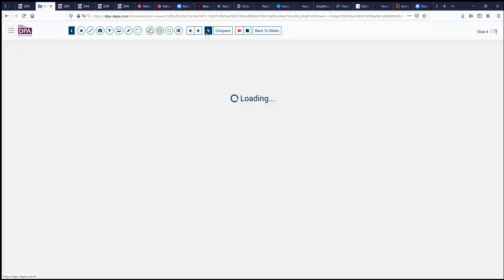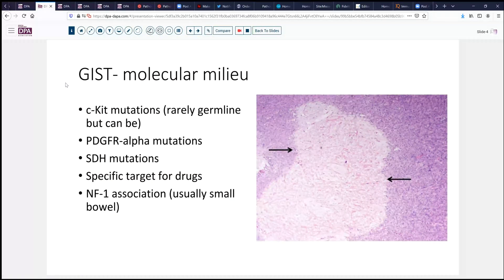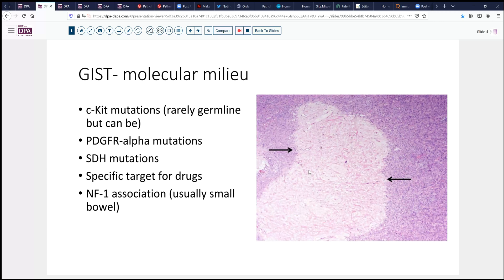These lesions are associated with a couple of different mutations. The most common are CKIT mutations, which although rarely germline, can be germline mutations. They also have platelet-derived growth factor alpha mutations, and in some circumstances can have succinate dehydrogenase mutations. These may prompt different targeting drugs, so that sometimes is important to recognize. I pointed out the areas of hypocellularity that we can see in some areas, and sometimes this change is quite abrupt, as you see here. Also, these tumors can be associated with neurofibromatosis type 1, particularly if they present in the small bowel.